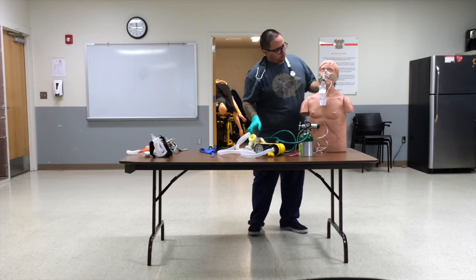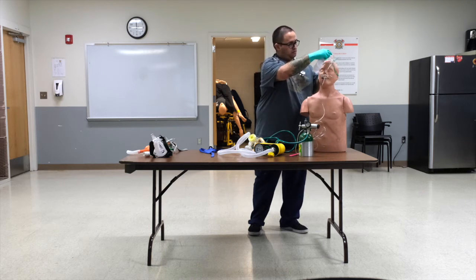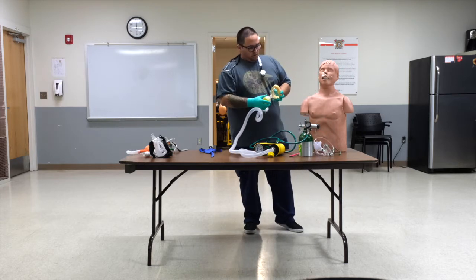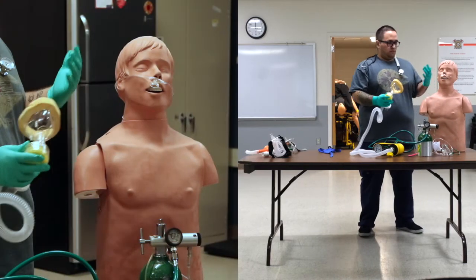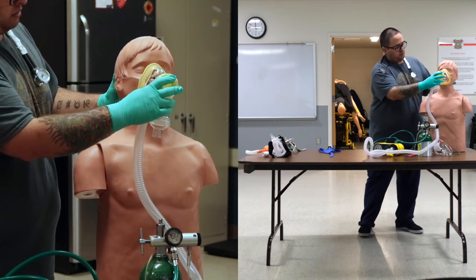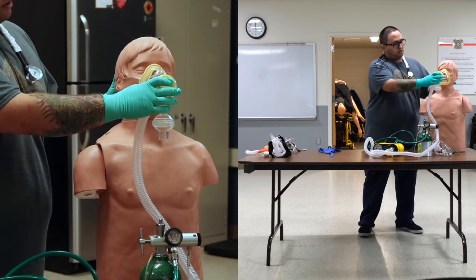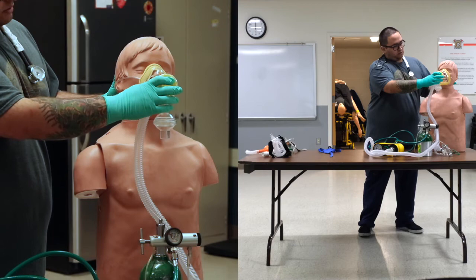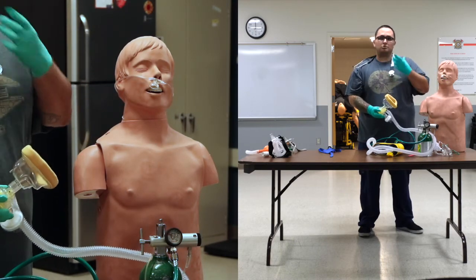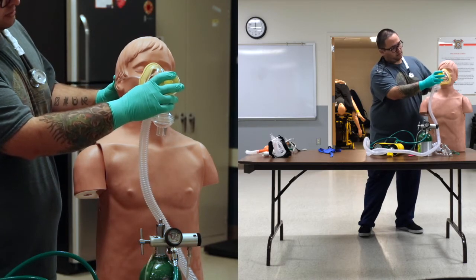So sir, we're going to place you on CPAP. It's going to be a little bit uncomfortable. It's going to feel like air is rushing in. It might be a little bit more difficult to breathe out. So before we fully secure the mask, I usually like to have the patient bring the mask up to their face, hold their head in place, and have them take a few deep breaths to see how they tolerate the machine. The goal is that this foam section seals very nicely around the skin because we don't want air leaking out. So we want to be able to get a nice, good seal.